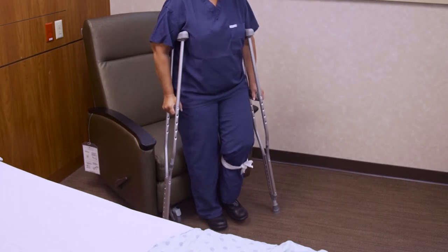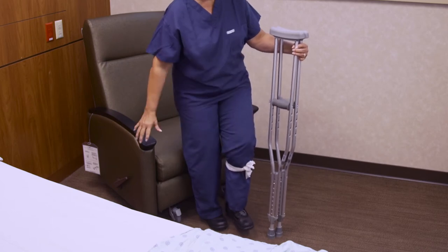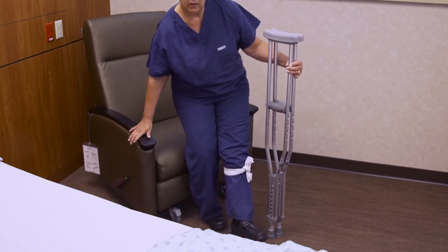To safely sit down, with your back to the seat, touch your good leg to the chair. Hold your crutches on your surgical side. Extend your surgical leg outward and use your free hand to brace your weight on the armrest as you sit.